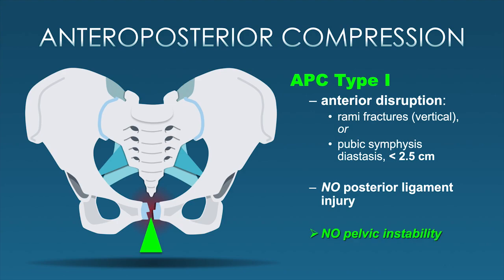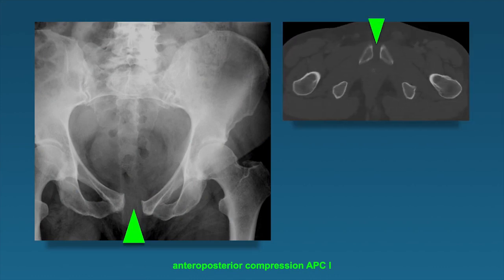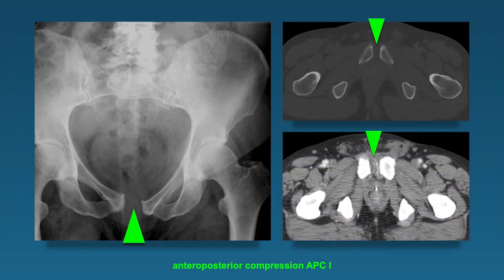Here is what APC type 1 looks like on the radiograph—some opening and widening of the pubic symphysis. Here it is on CT. Remember, when imaging these patients they may already be placed in a pelvic binder or have a sheet tied around them, so some injuries can be reduced at the time of imaging. Take a look and see if you can identify if the patient is in a binder. Notice that this patient is in fact bleeding anteriorly in between the symphysis on the soft tissue window.